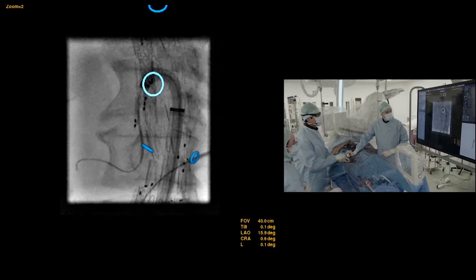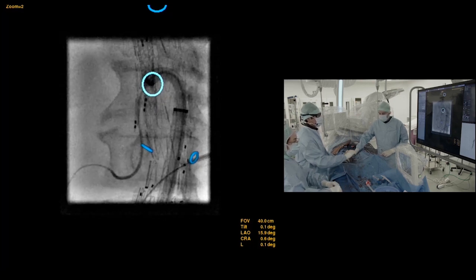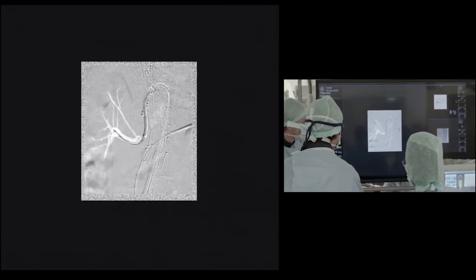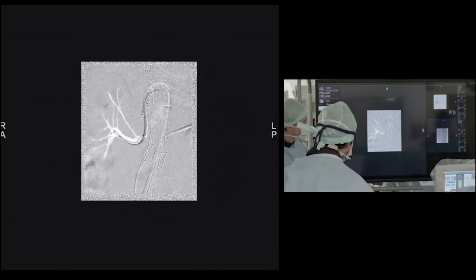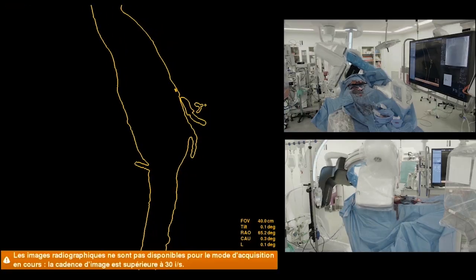Okay, that's perfect. Sometimes you need luck, and I think it looks pretty good. Let me double check where I am. Well, this seems to be the right kidney. Now Justine's going to deflate the balloon, and I'm going to advance the sheath back inside. Rotation.